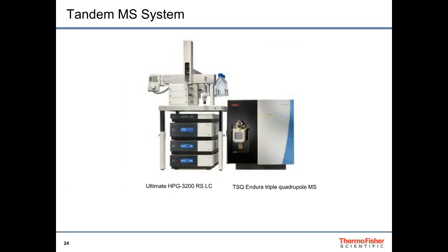This is the LC-MS system used to analyze the prepared samples using flow injection without chromatography. The system consisted of an Ultimate binary UHPLC pump and an open Accela autosampler for flow injections to the heated electrospray ionization source of a TSQ Endura tandem mass spectrometer. And of course, all of these are from Thermo Fisher Scientific.